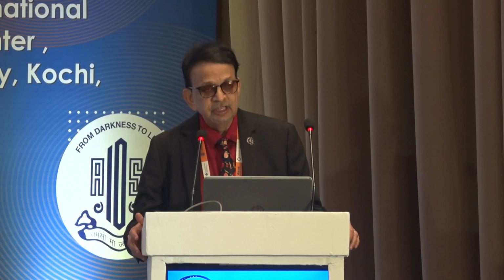Just to show you another patient, you can see here I've done the main incision, I've done the side port incision as well. The advantage of the femto laser assisted incision is that it is truly a triplanar incision. The only thing is the incisions are a little corneal, but if you have dense arcus senilis, probably the incisions will not work. You can see here how the cataract is quite dense. You can see the pre-chopping has already been done. You can see the cuts into the nucleus. And I just need to go in and bury the phaco.